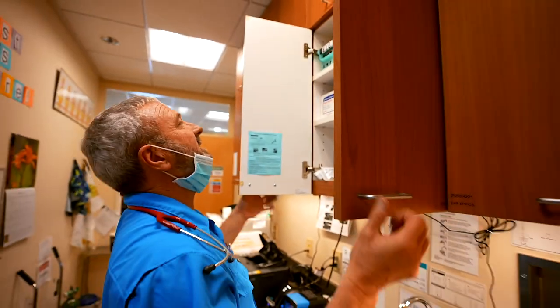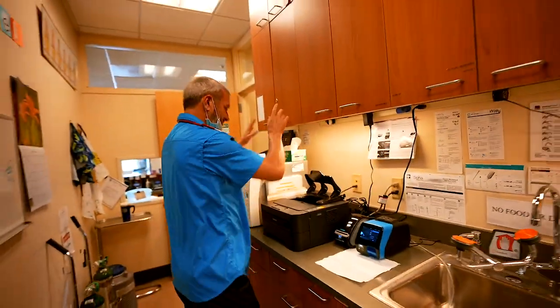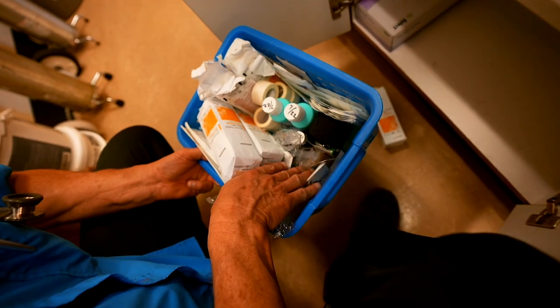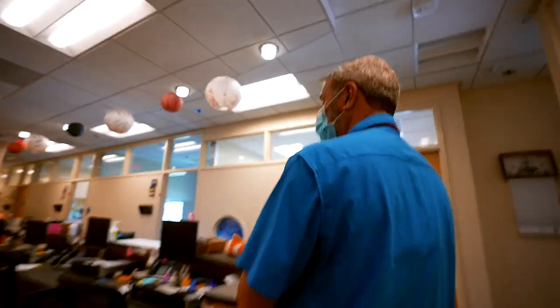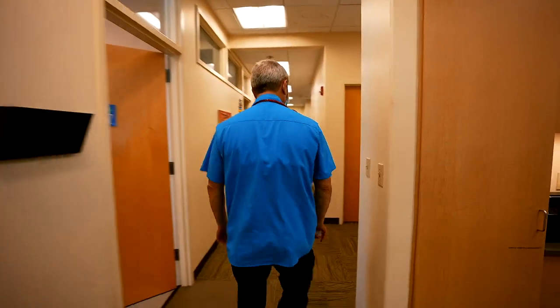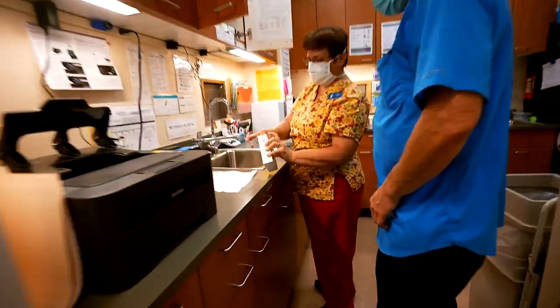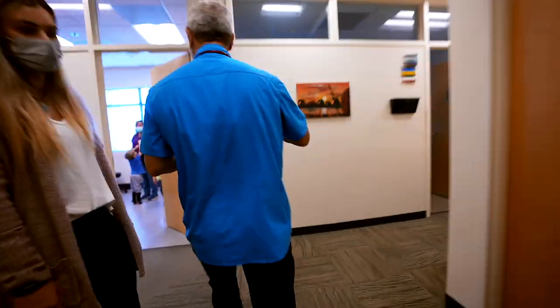I am not finding what I want. Rapid test. We're gonna show you how disorganized I am — we're out of Steri-Strips. Where oh where are the nurses? Can't find Steri-Strips or even the kind of band-aids one might use to put something together. These are called reinforced skin closures.